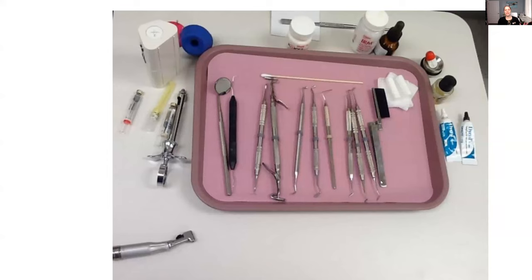Let me just share my screen here for you. Unfortunately it's a little bit of a blurry picture, but this was the best one I could find, and it truly does show the IRM tray setup. It almost looks like they started setting up for an amalgam as well, because they have the amalgam condenser here, which you really don't need — but I wanted to show you what things look like.